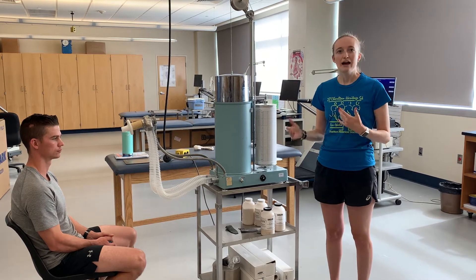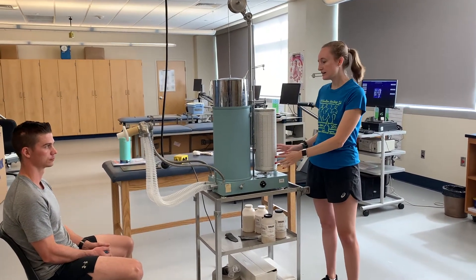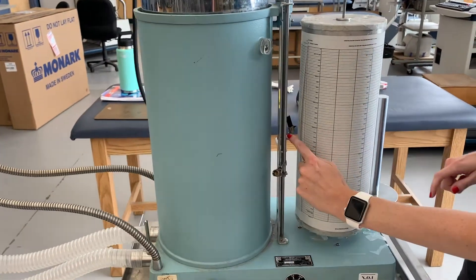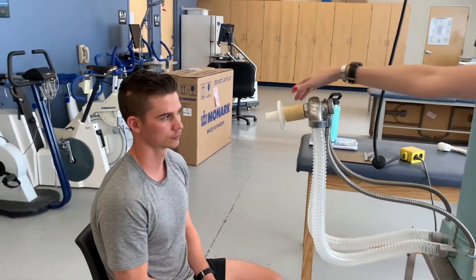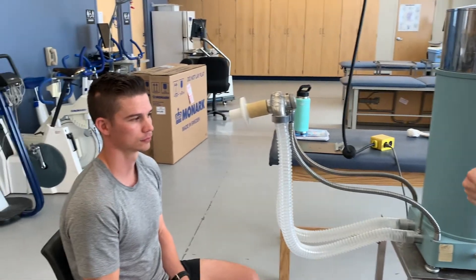I'll walk you through how we're going to do this using the bell spirometer. We have recording paper on here which will have the tracing of his forced vital capacity, and a little pen that will do the tracing while he's breathing. Over here on Ethan we have an antibacterial filter on the end to make sure he's breathing nice clean air, and nose clips so that everything he's breathing comes straight out of his mouth and not his nose.